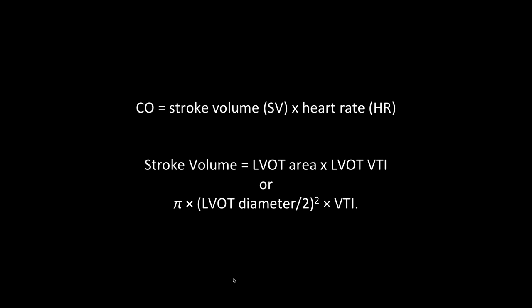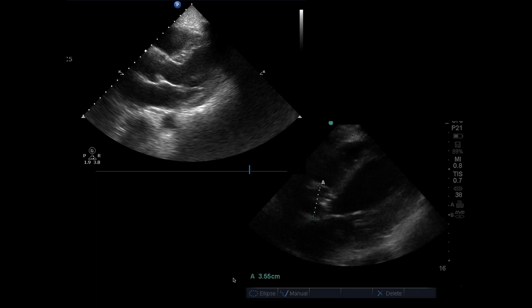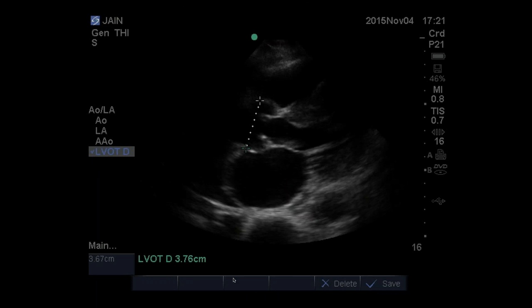For the LVOT area, we use the diameter and then pi r squared. In parasternal long, those parallel lines are the aorta, and the aortic valve sits at the beginning. We do our measurement just on the ventricular side of the aortic valve — as close to the heart as possible — so we can see stroke volume as it leaves the heart. Here the LVOT diameter is 3.76 cm.